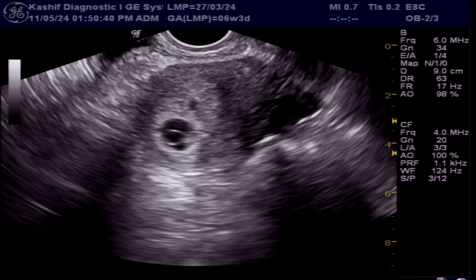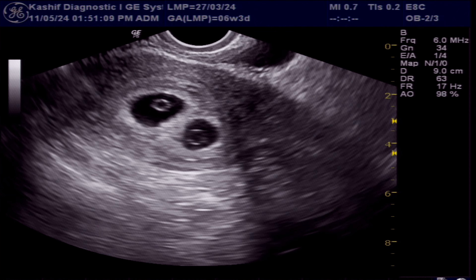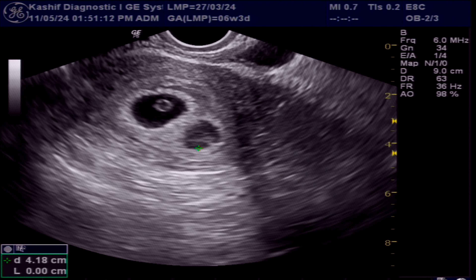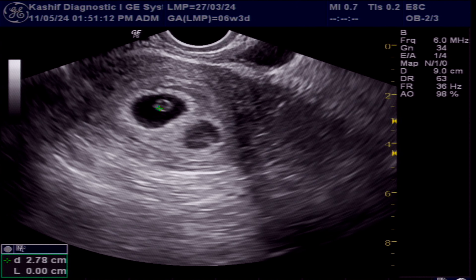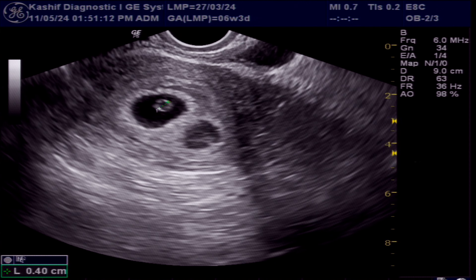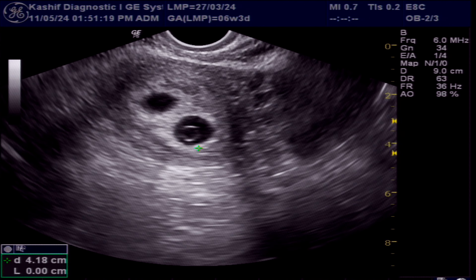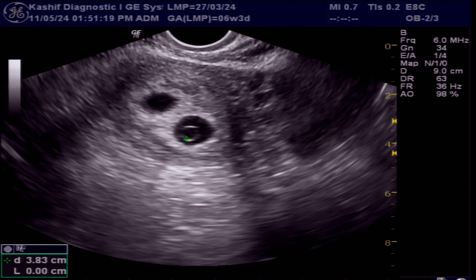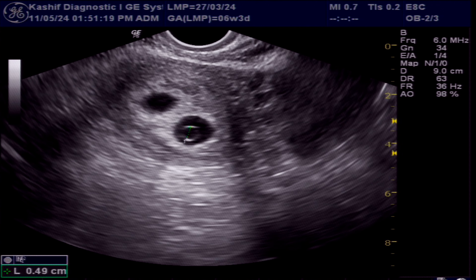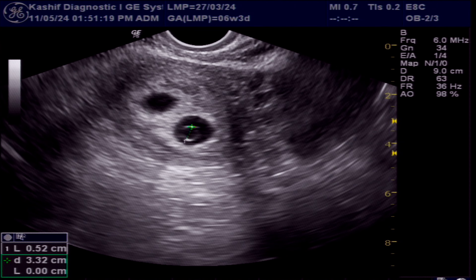This is a normal, alive intrauterine twin pregnancy at 6 weeks. A small yolk sac is seen in both gestational sacs, measuring 4 mm and 5.2 mm respectively. Less than 6 mm is within normal limits.